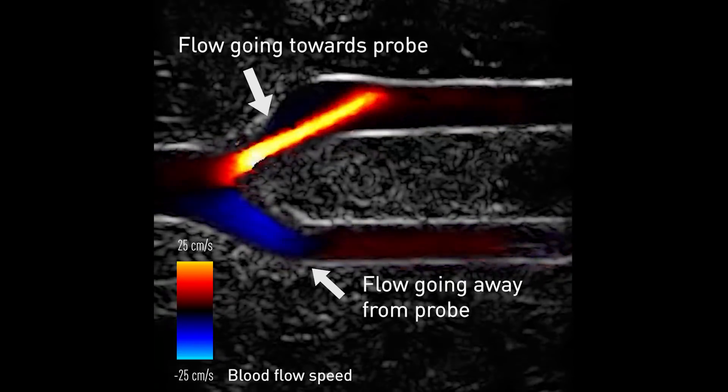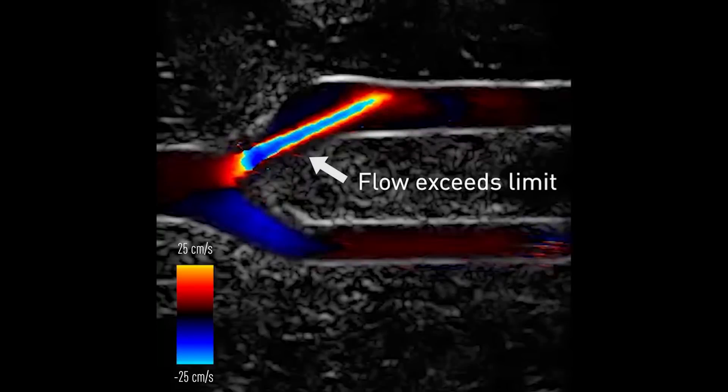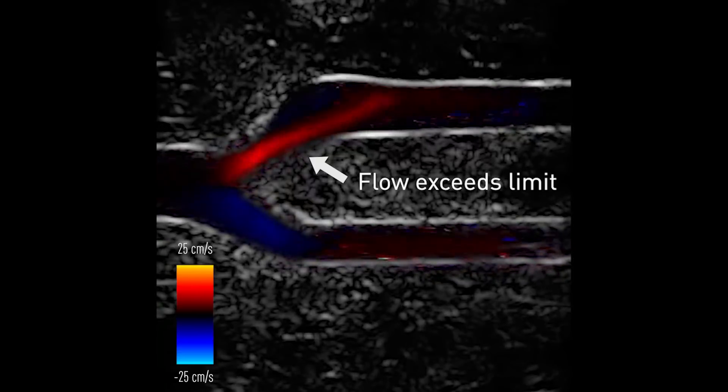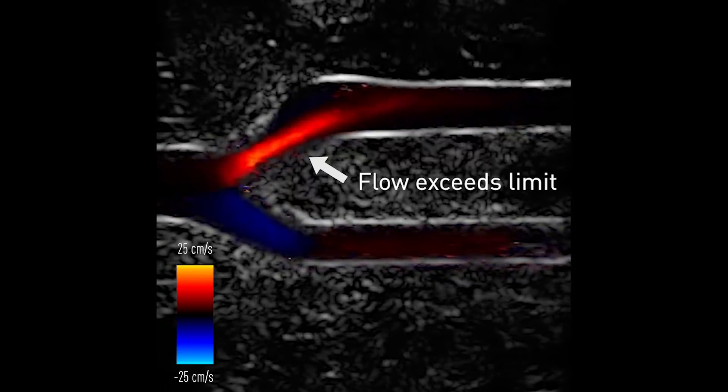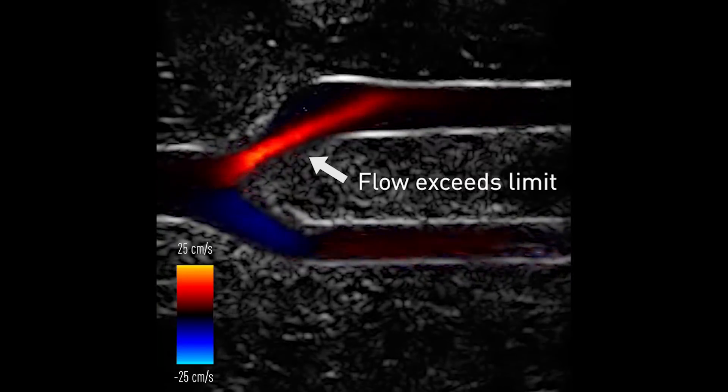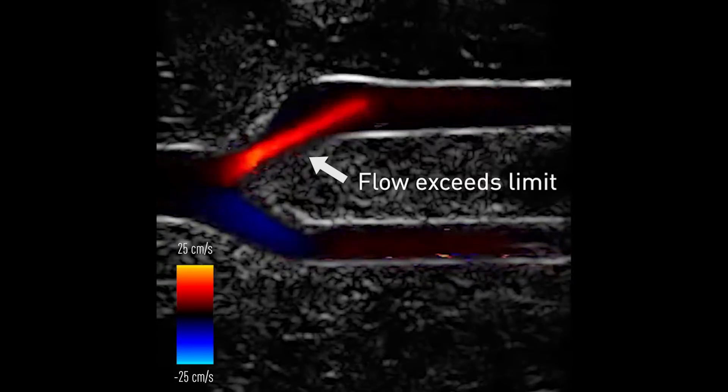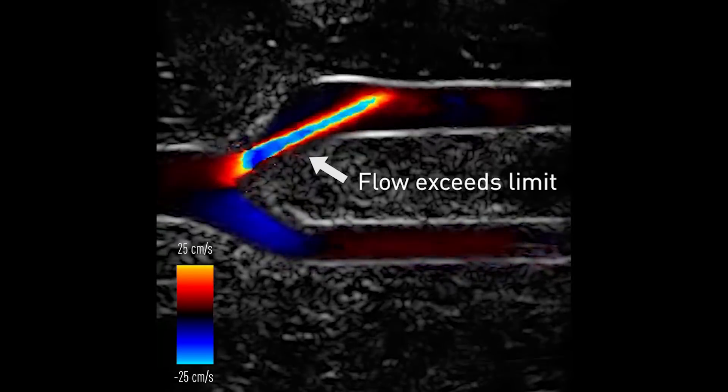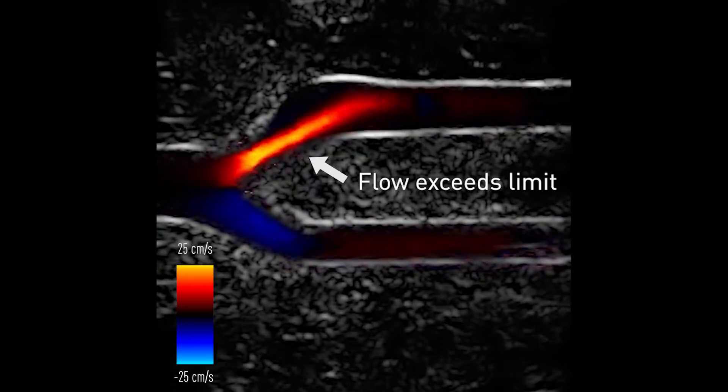Or at least they're supposed to. In the image on screen, blood in the upper branch is moving up towards the probe and should be colored red. But when blood is moving very quickly, it can actually exceed the rate at which existing instruments can correctly determine the speed. This causes what's called aliasing, and the color code switches from red to blue, incorrectly indicating that the blood is moving in the opposite direction.